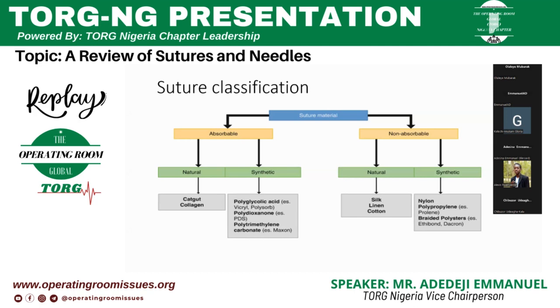Polydioxanone, that's PDS, can take as much as 210 days in the body. However, let me quickly go to the next slide. So basically, that's the superior advantage of synthetic suture over the non-synthetic sutures.